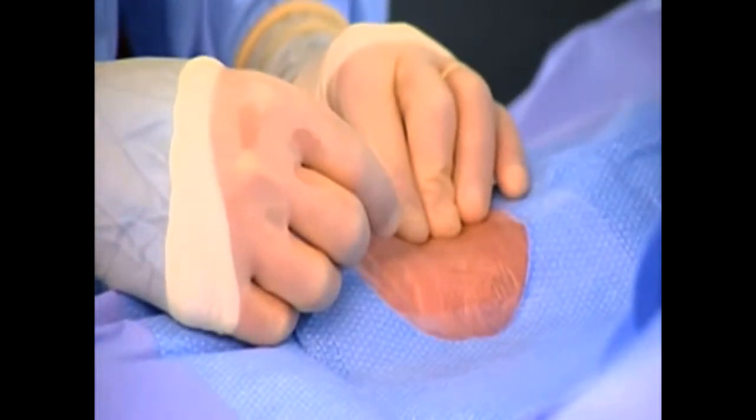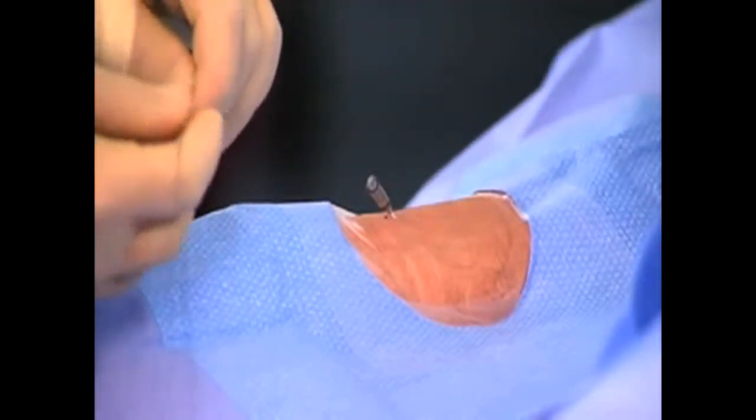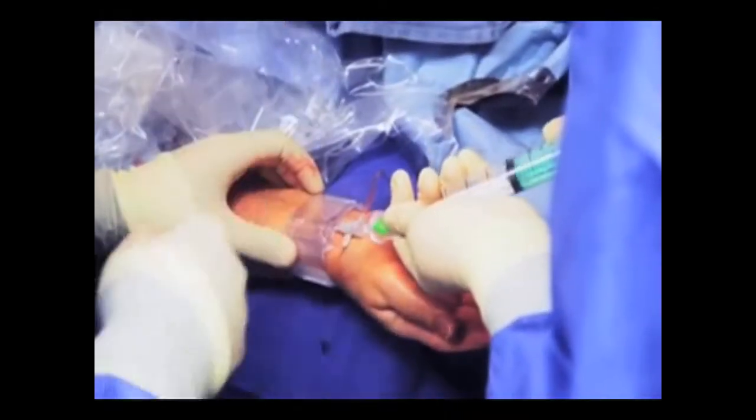What other areas of the body can be treated with this new procedure? We can work on the carotid arteries. We can work on the subclavian artery, which is the main artery in the arm that vascular surgeons used to do bypass surgery to treat. Now we can fix it through the same tiny hole in the skin with a stent and a balloon. Or we can go down to the heart, which is primarily what we do, and fix the blocked arteries through the same tiny hole. I have personally gone down to the kidneys and fixed blocked arteries in the kidneys, and down to the legs.